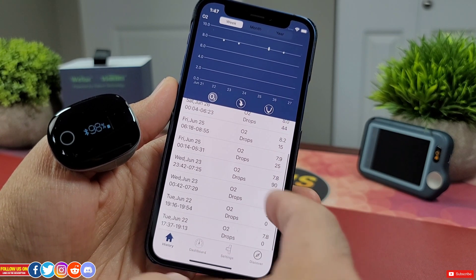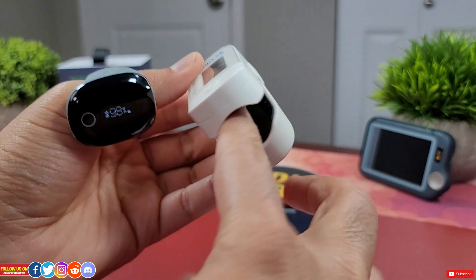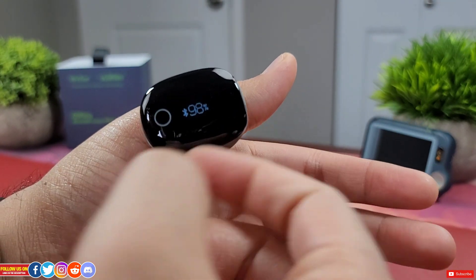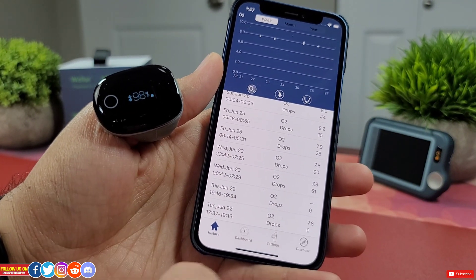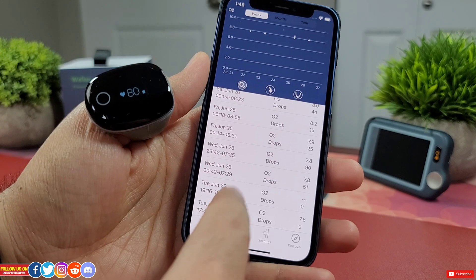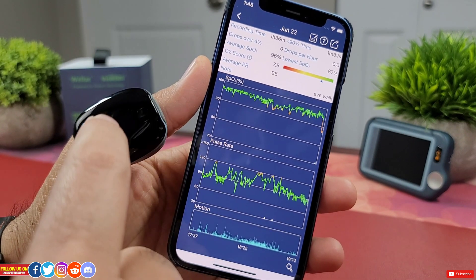Let me briefly explain why you should use this O2 ring over a finger oximeter. A finger oximeter is for one-time SpO2 or heart rate readings and cannot be used for sleep tests as it can easily fall off. This O2 ring can do both real-time readings and nighttime monitoring — being a ring it doesn't fall off, and it continuously stores the entire night's reading including SpO2, heart rate and motion data. If you have a sleep disorder you can use it for a home-based sleep test. I don't recommend it to replace a medical sleep study, despite the O2 ring being FDA approved. Nonetheless, the readings can be of great value to your doctor.